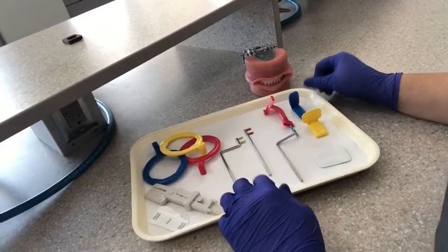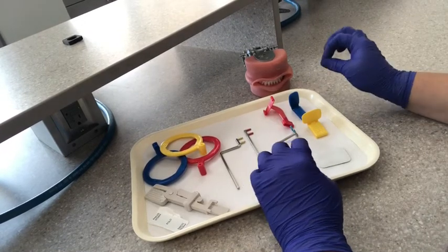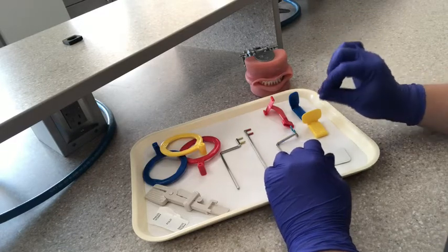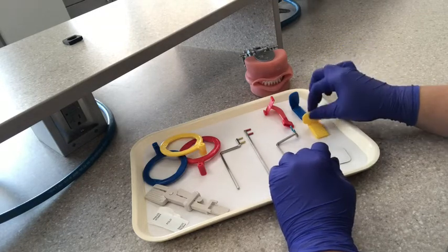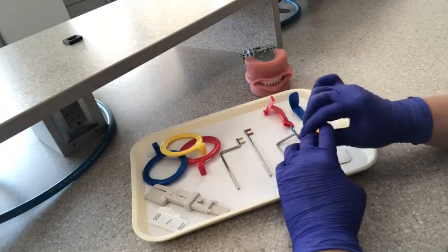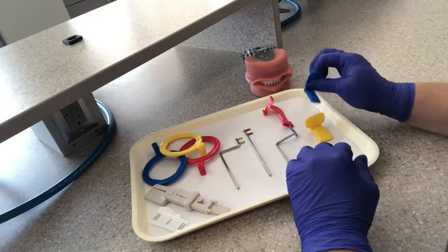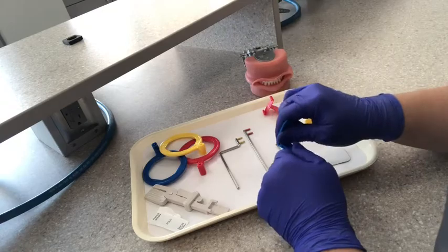Now that we've assembled the posterior, let's go ahead and show you how to assemble the anterior. You'll hear us say the word PA — that is just a shortened version of the word periapical. Periapical means that we're looking at the end of the root or around the root. So the posterior XCP is for a posterior PA, meaning we want to get an x-ray of the roots of the teeth. And the anterior XCP is the device we use to get an x-ray of the roots of the anterior teeth.